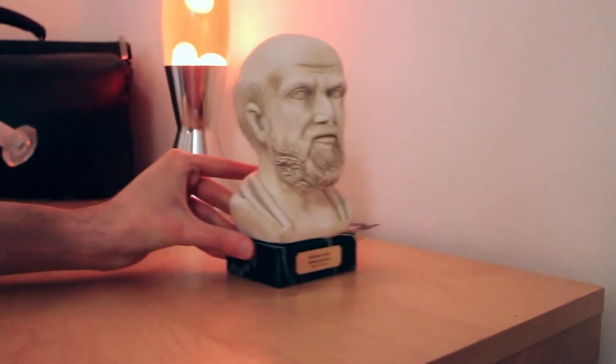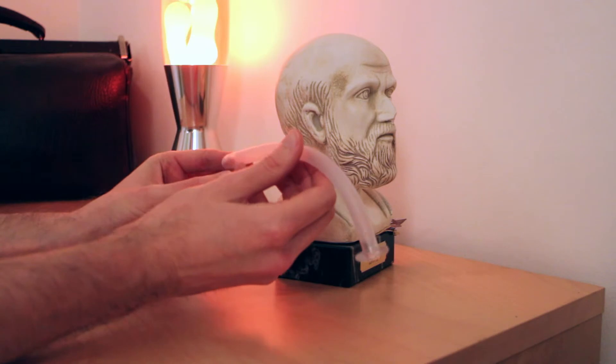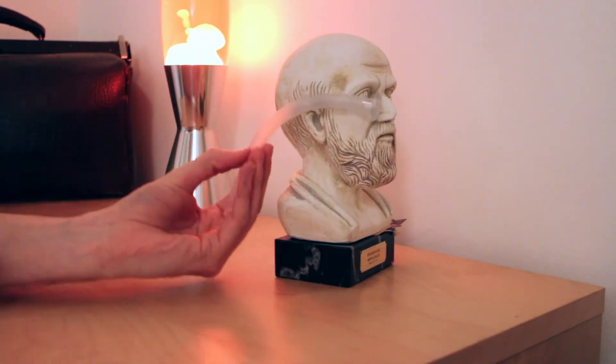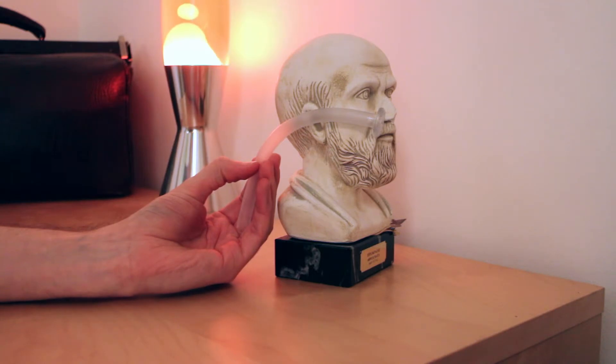You can demonstrate its use with the help of a model. This device is inserted into the nose with lubrication on this end, where it sits at the back of the nose. It is used in manual ventilation of a patient in respiratory arrest or with respiratory depression and a reduced level of consciousness.